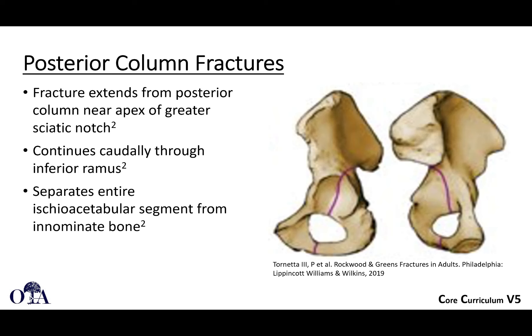Posterior column fractures are somewhat uncommon. The fracture extends from the posterior column usually near the apex of the greater sciatic notch. As opposed to anterior column fractures where fracture lines can go up the wing, posterior column fractures generally stay down near the greater sciatic notch. As with any column fracture, they fracture through the obturator ring — you see this fracture line come down through the ring — and this separates the entire ischioacetabular segment from the innominate bone.